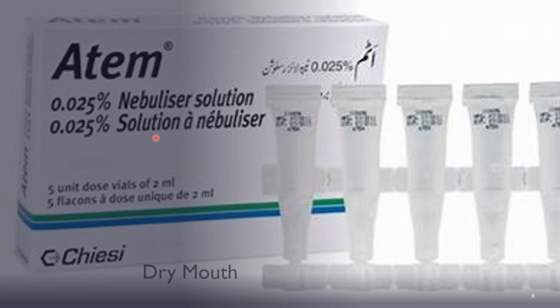Second side effect of the nebulizer solution with the ipratropium is in those patients with preceding eye condition like glaucoma. So it can precipitate, as the mist which forms in the nebulizer during the face mask can go to the eyes and precipitate acute glaucoma in patients with glaucoma. And then other side effect is in patients with prostate hypertrophy, it can happen as the retention of the urine. So be careful in these patients to use it.